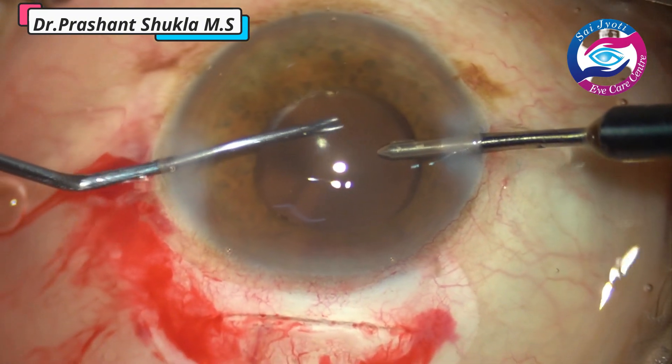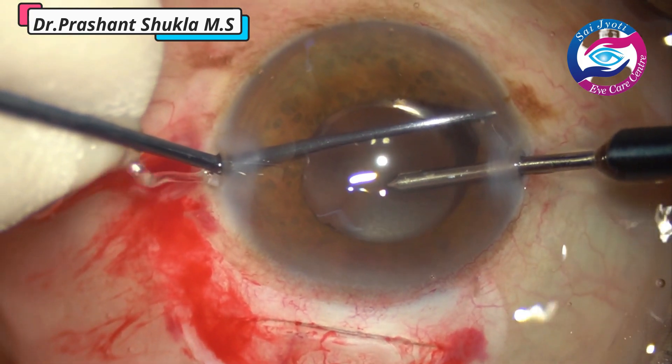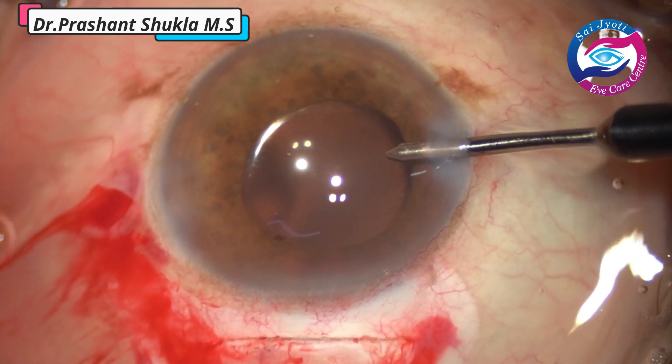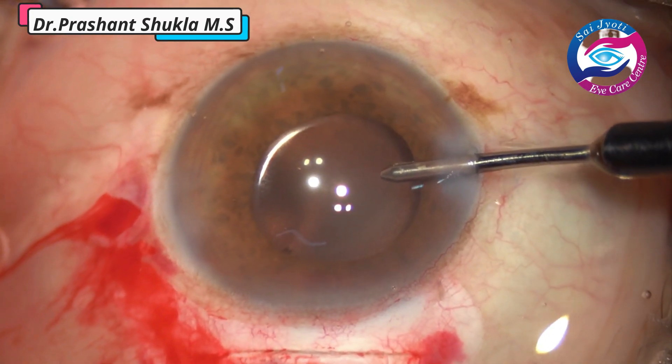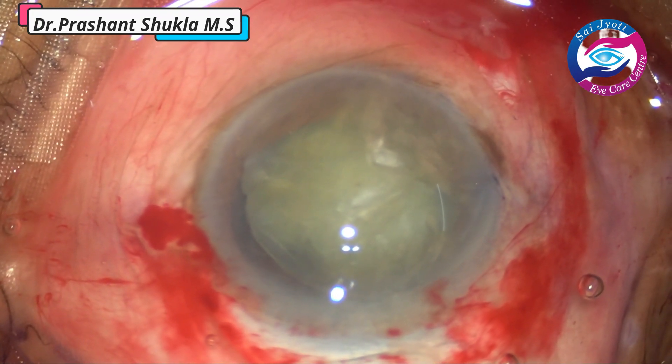Here I am using a Y-shaped instrument just to check whether the haptics are in the capsular bag and that we are not left with any cortex which gives a surprise the next day. This is another case.